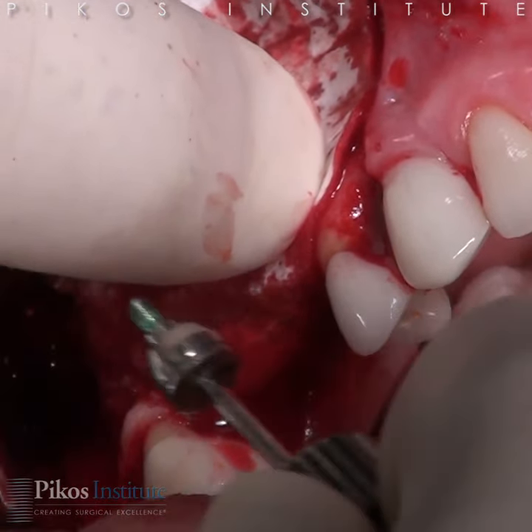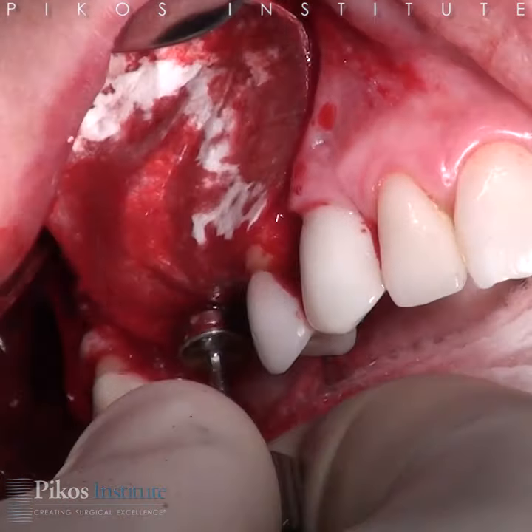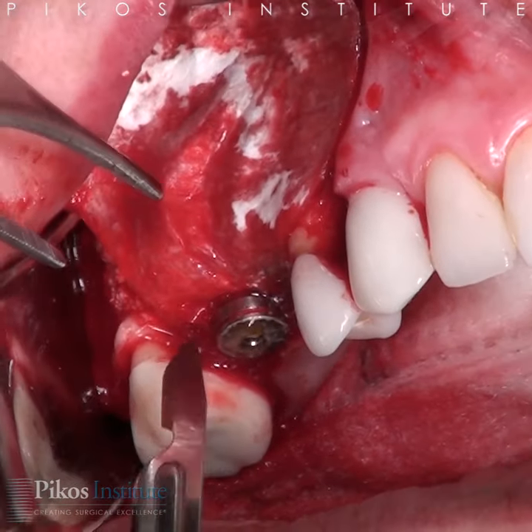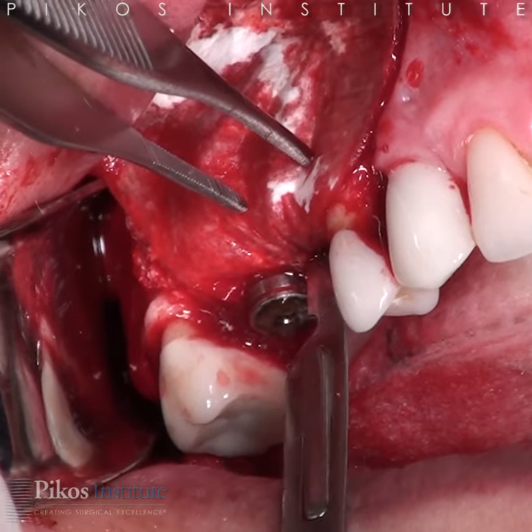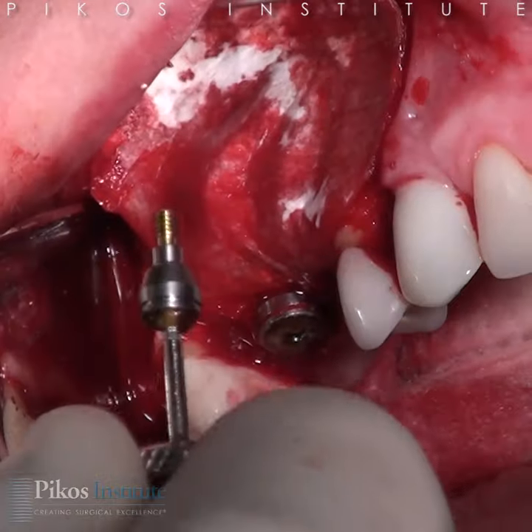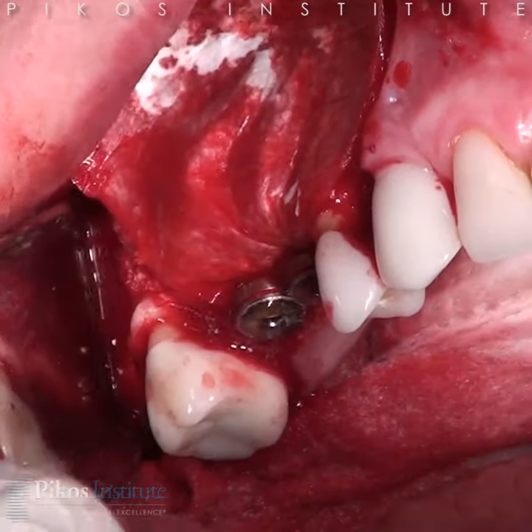This is the 4-6, 3 millimeter height healing abutment. We'll just come in through that small perf that we made — and there it is, secured well. We'll do the same thing anteriorly. Here's the 3-8 millimeter diameter healing abutment, 3 millimeter length, and that secures it quite well, as you see there.